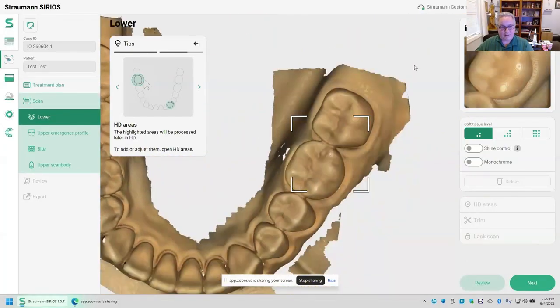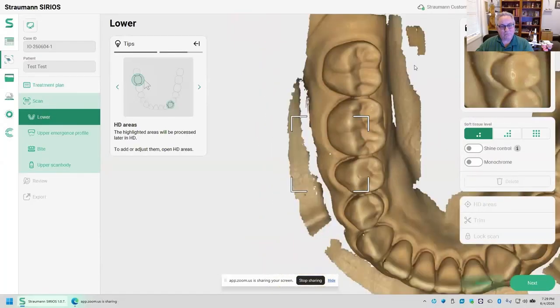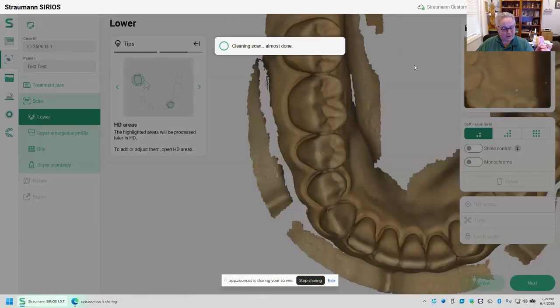Okay, this is just my antagonist. Let me just review and make sure I got all the occlusal table. I do. Okay, so good enough. I can stop right there.